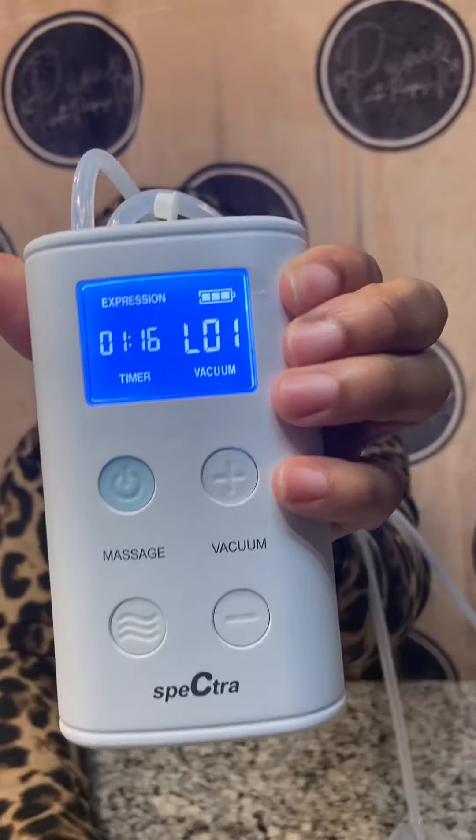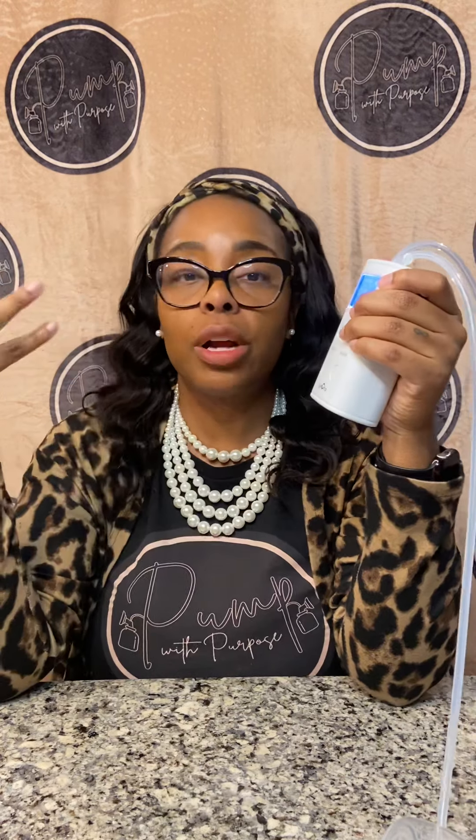Expression mode has levels one through ten — it is very slow at level one and goes up to level ten. It does not go up to level 12 like the normal Spectra. And it's not really the same as the Spectra because you can customize the full Spectras to whatever cycle works best for you.